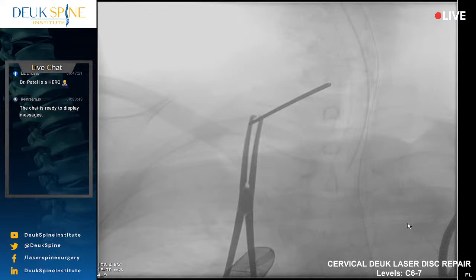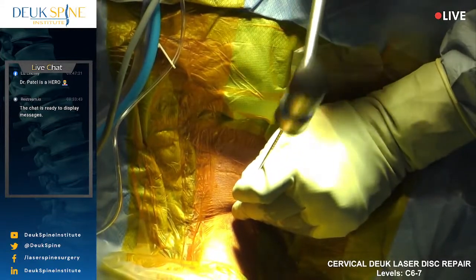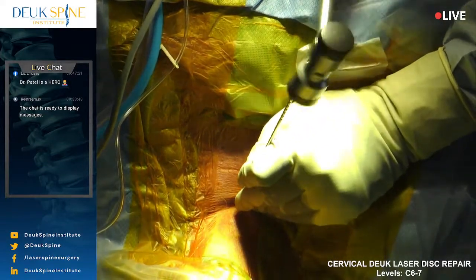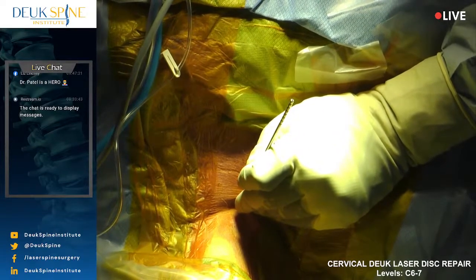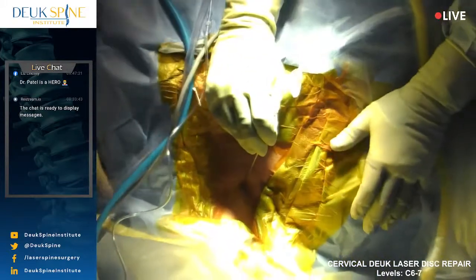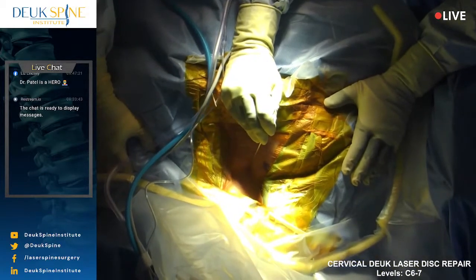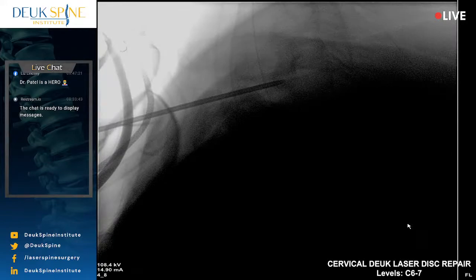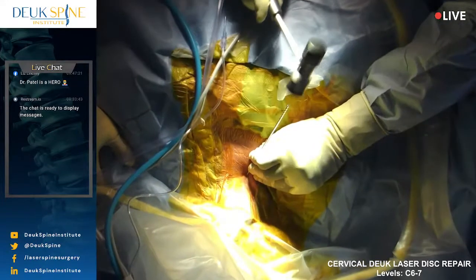So now I'm going to advance. I'm underneath the bone spur. I'm going to advance my dilator into the disc, and I feel it moving already, which is a good sign. So I will need another shoulder pull. Guys, I need the head stabilized, otherwise you'll just pull the whole body south. Hey, that's perfect right there. Nice. So I'm angling up, and I'm going to advance the dilator into this C6-7 disc space.